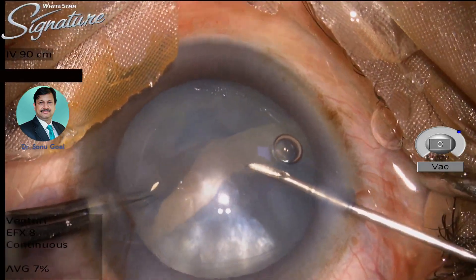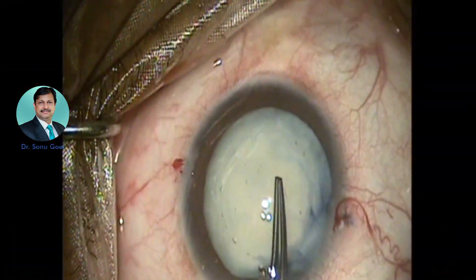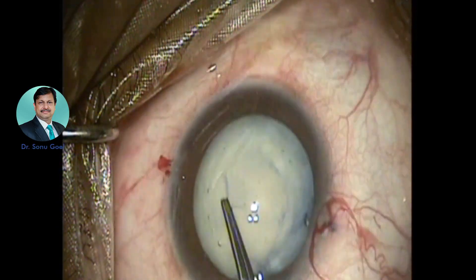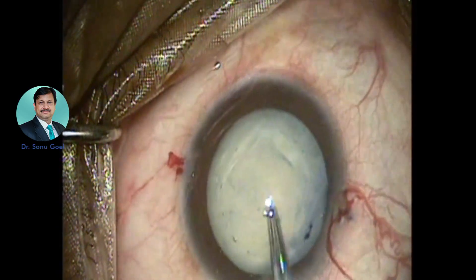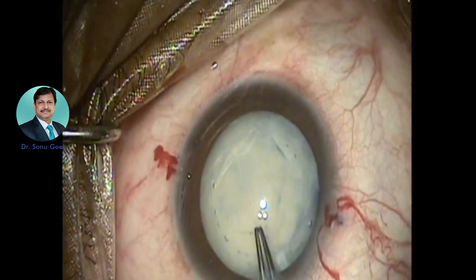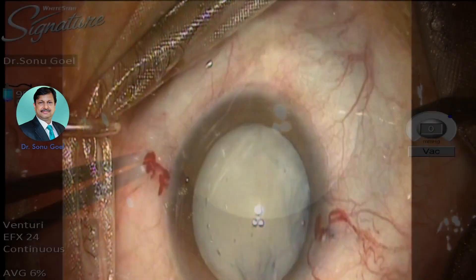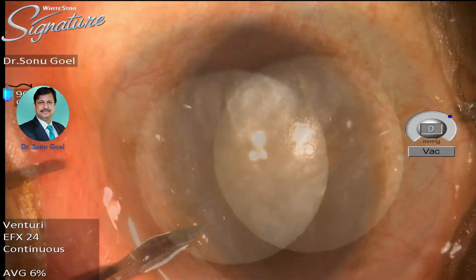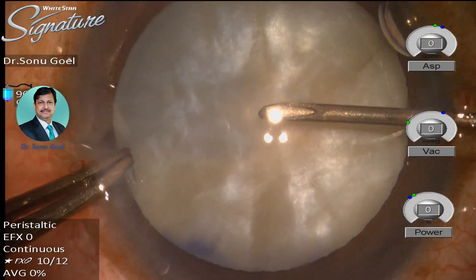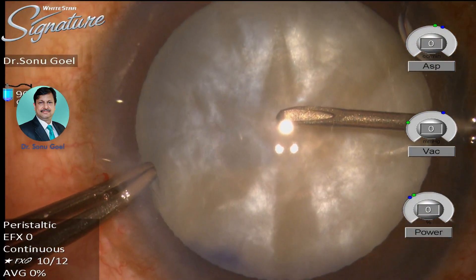With high intralenticular pressures, femtosecond platforms and different platforms to create rhexis have been a great boon in these situations, but not everybody and not every patient can afford them. We, as routine phaco-surgeons, should be able to take on this challenge. Here we present our way of managing these patients.